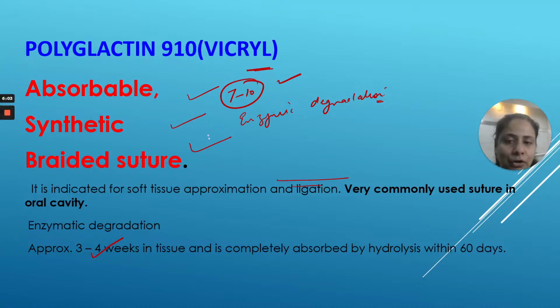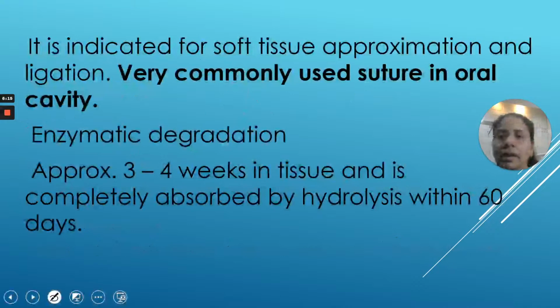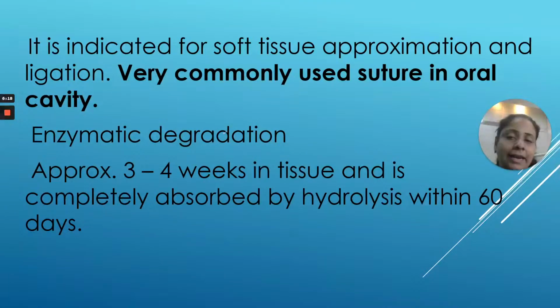For your own knowledge, you should know that for 3 to 4 weeks it gets weakened and it gets completely absorbed within 60 days. And again I am telling you, this is a very commonly used suture material.